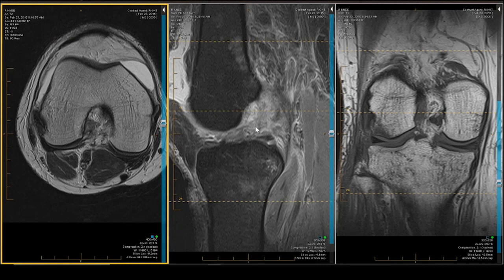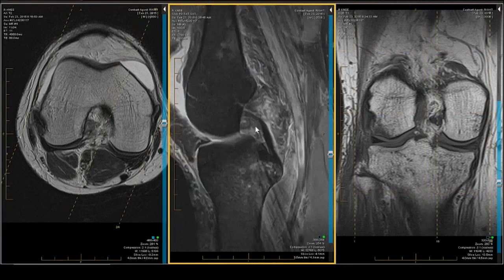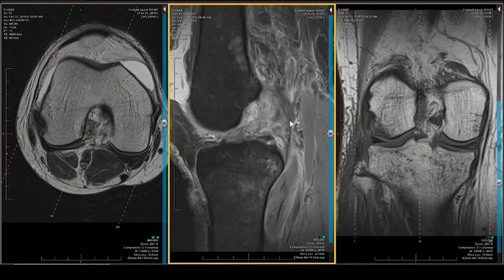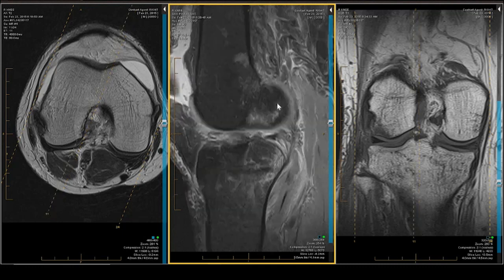The patient has had a violent pivot shift with rotation. The PCL is intact, but the posterior capsule — which also has fused to it the OPL — is torn superiorly. Where it should attach, all you see is an area of fuzzy gray signal intensity.